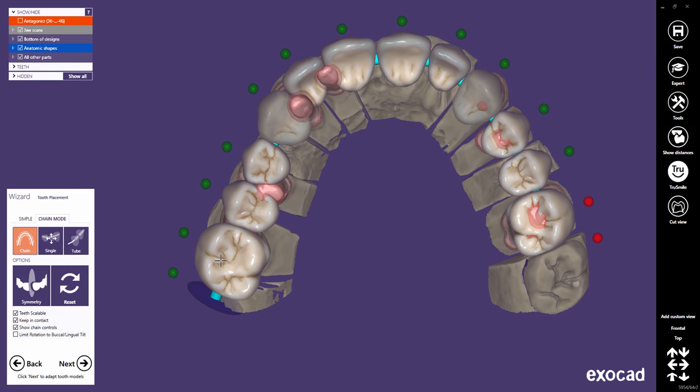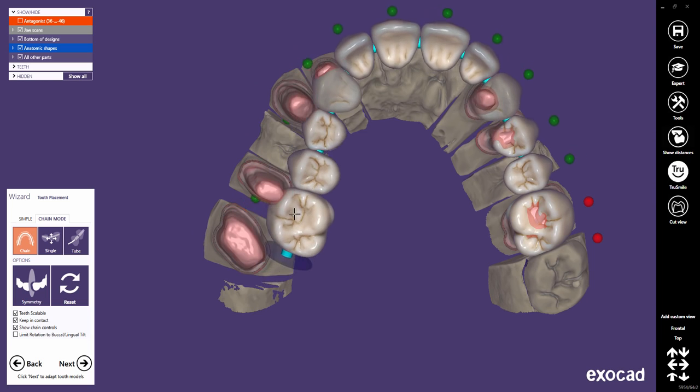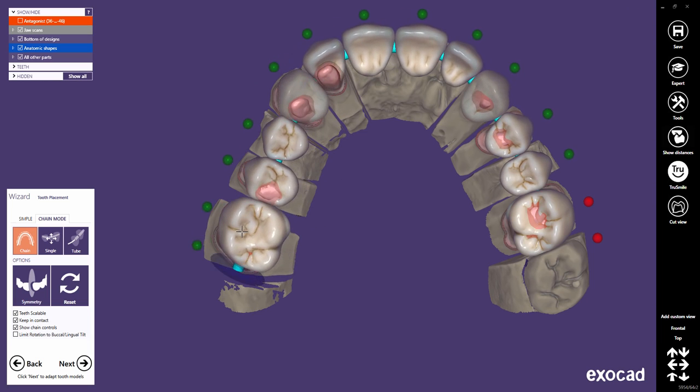In chain mode, you have the same options for tooth placement as in simple mode. Use the left mouse button to move parts of the chain.